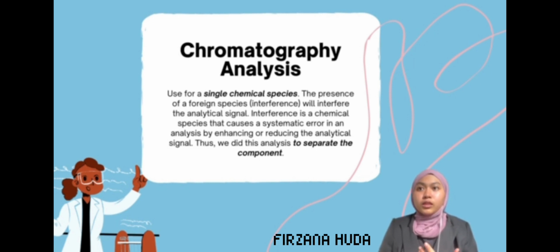So first I will be presenting chromatography analysis. It is used for a single chemical species. The presence of foreign species, which is interference, will interfere with the analytical signal. Interference is a chemical species that causes a systematic error in an analysis by enhancing or reducing the analytical signal. Thus, we did this analysis to separate the components.